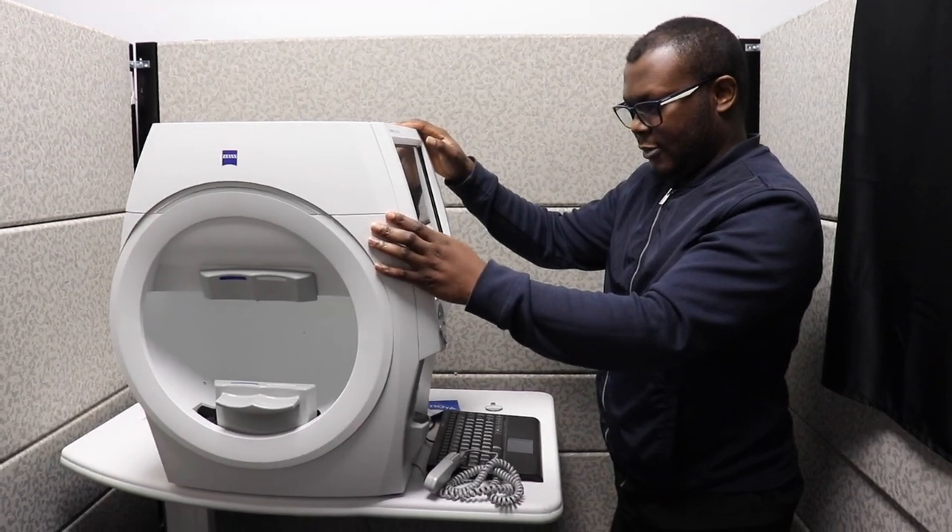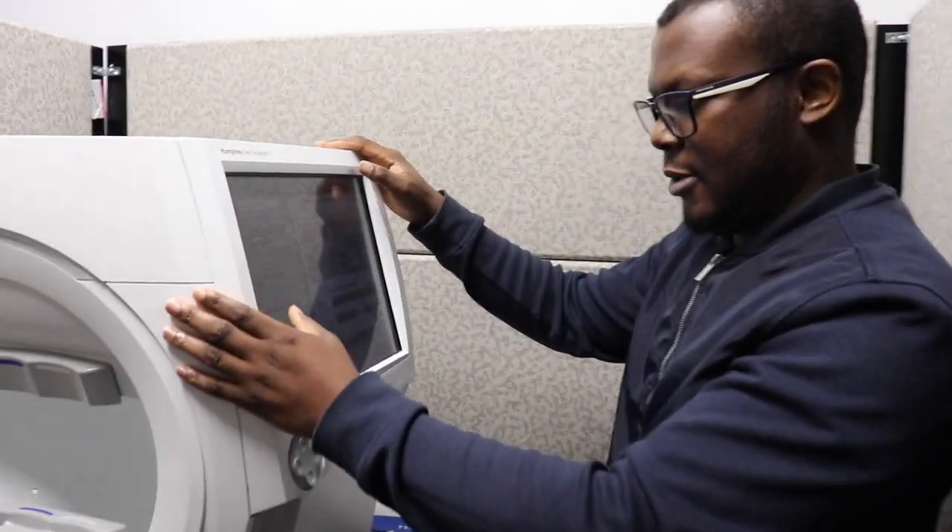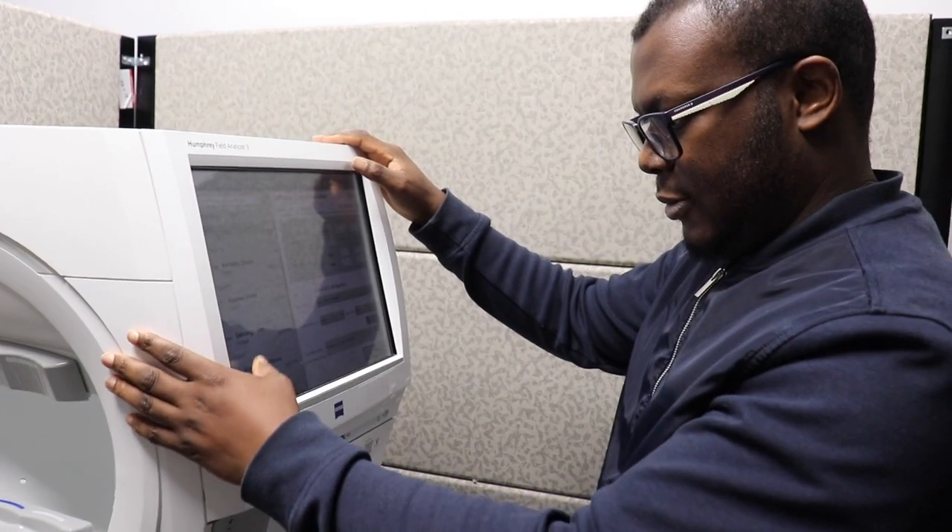If a patient does wear glasses, we do recommend that they bring their glasses in with them. If they're a contact lens wearer, they could probably do the test with their contact lenses on.